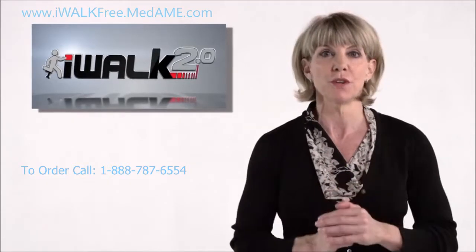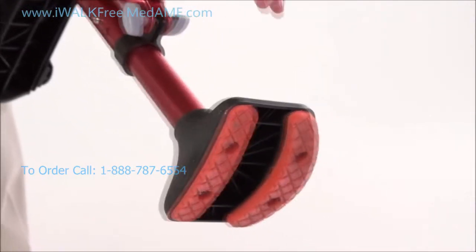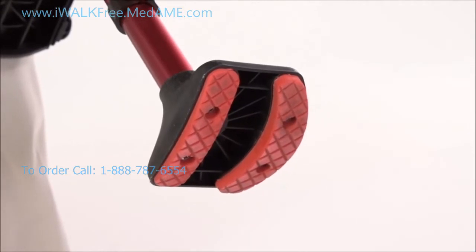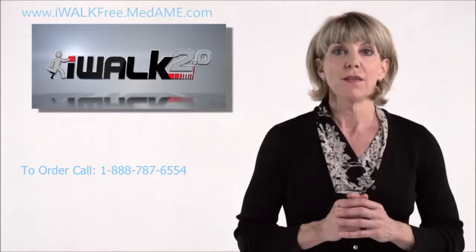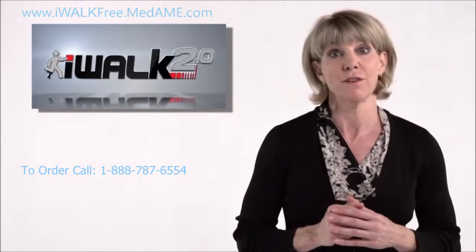The adjustment is easy and intuitive. Make sure that the curved edge is towards the outside. So if you're setting up your crutch for your right leg, the curved part goes towards the right. For the left leg, it's the opposite. This is a critical safety feature, so make sure that you have it correct before you go any further.